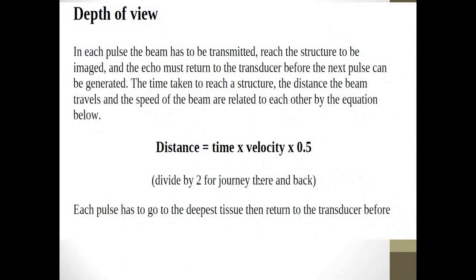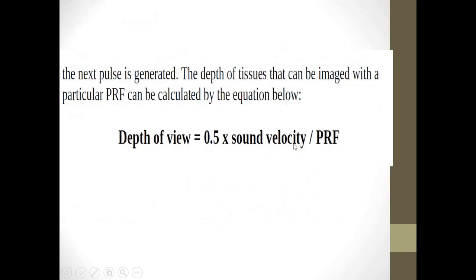We talked about depth calculations and how to determine the depth or the location from which the signal or your pulse is coming, of course, through the time of flight equation, and we linked it to the pulse repetition frequency last time.